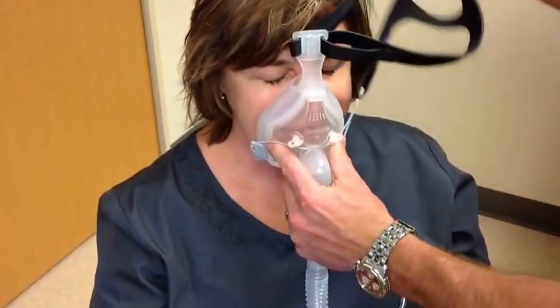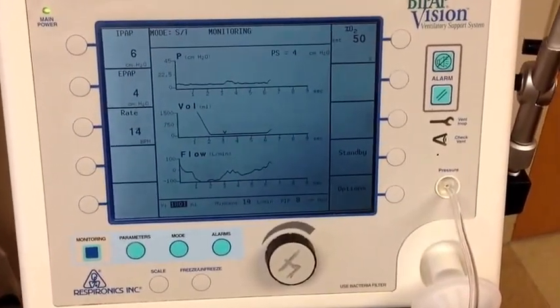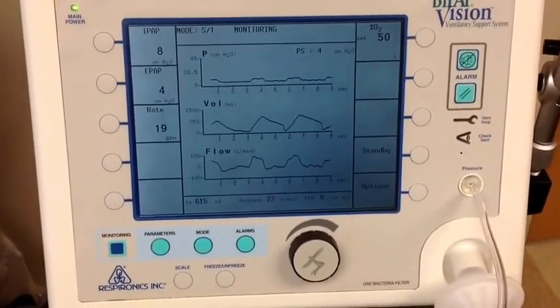The machine will automatically restart working again. Right this way. Note that the straps should not require adjusting, although there may be times when they will.